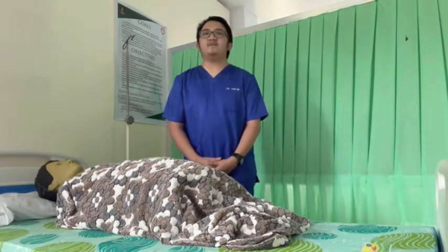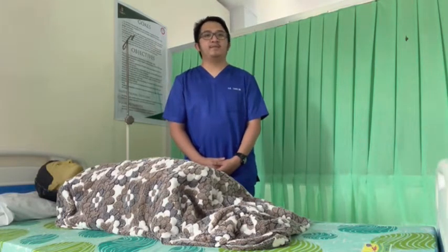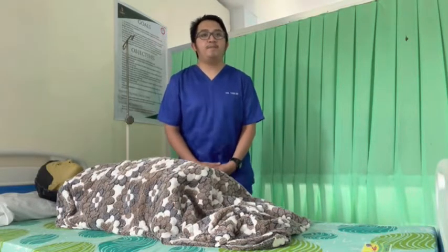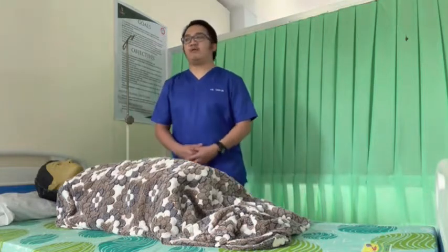Okay, so the first step is to determine whether written consent for the procedure has been obtained, to prevent potential error.